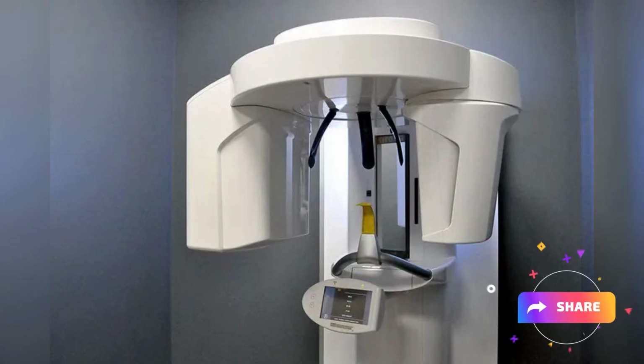Don't do that. Secondly, when so many practitioners don't get those canals, they try to use the burrs deep to find those canals. And what happens? It creates lots of ledges, lots of pseudo canals in the pulpal floor. Don't do that. How to find canals? If you are not able to find a canal, always take the help of CBCT. CBCT is a very important tool in finding the canals if it is required. But don't create those new canals using a burr. Don't dig it. You will never find a canal and you will end up spoiling the tooth. Two of the biggest mistakes.